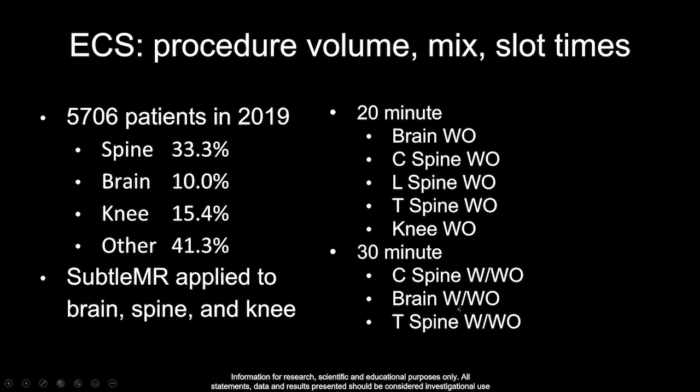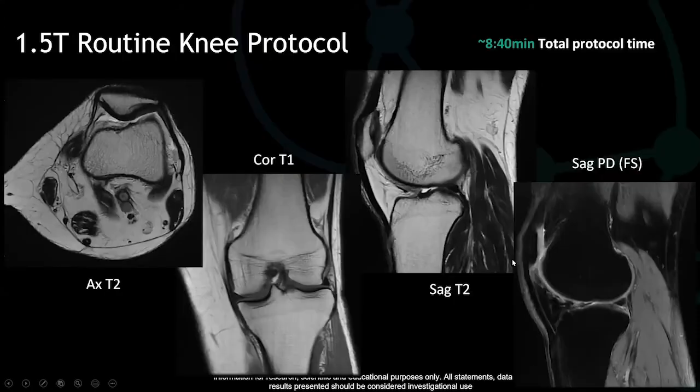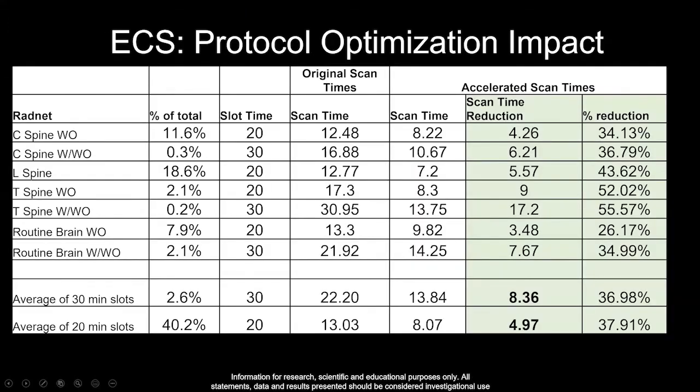You're not seeing quite as much of our imaging falling into the typical outpatient imaging realm. But even in this trial, we're still 60% applicable to what we can cover with the deep learning software from Subtle. You notice in the East Coast, we were already at 20 and 30-minute slots, and we use these tools to try to go faster. Here you can see what the knees look like at 8 minutes and 40 seconds, with all the usual suspects. And you can see that, even though we've achieved quite a bit of acceleration with our protocols, we're still able to maintain the image quality.